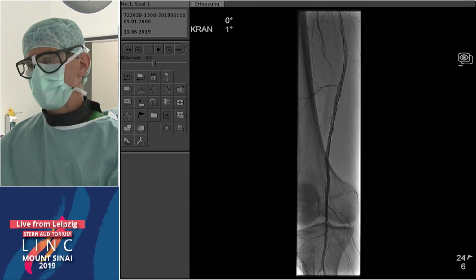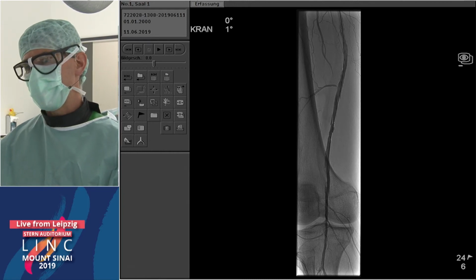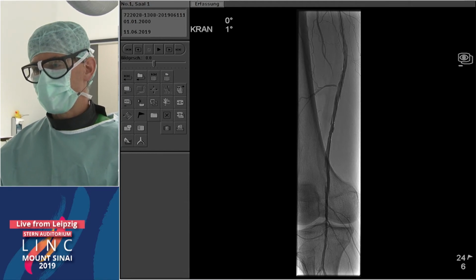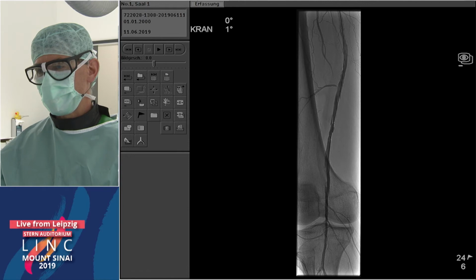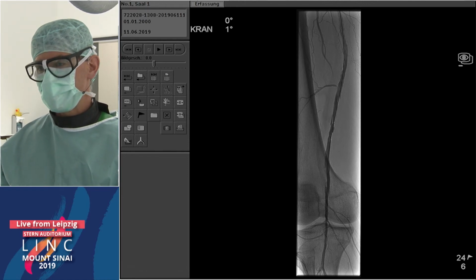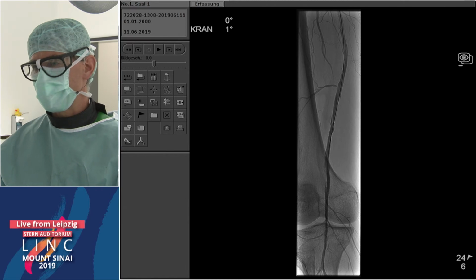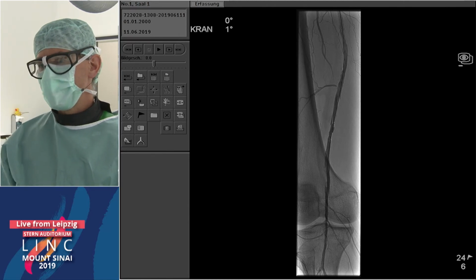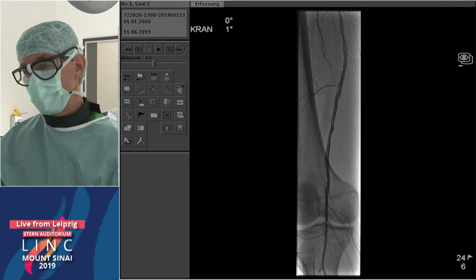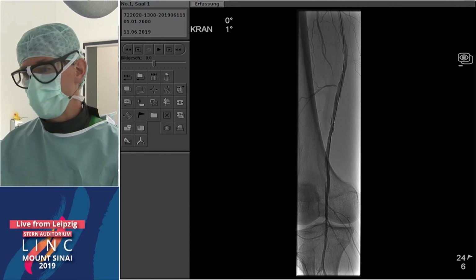So I personally, first, a relatively young man, very small arteries, first time here for treatment of claudication, I actually wouldn't like to directly take a long stent in here. We know that especially these distal stents can really make problems, especially if it thromboses up. So either maybe TAC, as you said, Dirk, or wait if it remodels, very nice.